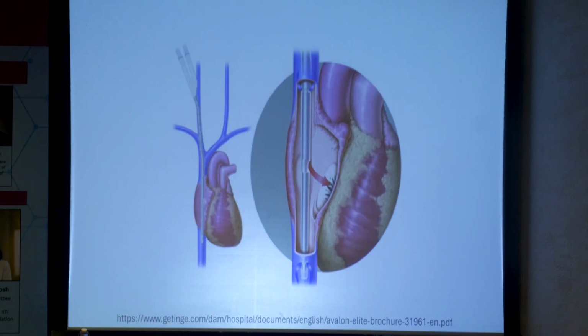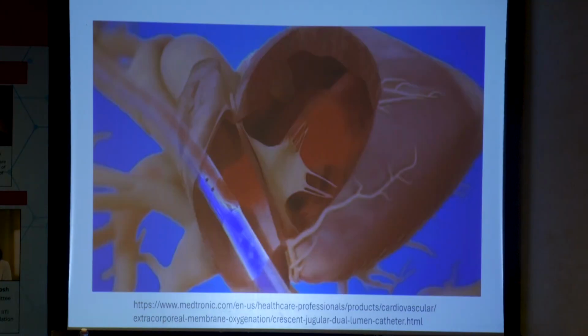And here's another. I went online and found multiple pictures just to really hammer home what we're looking at here. You want that blood flow to be going towards the tricuspid valve into the right ventricle. Here's one where they show it in red, going across the valve into the right ventricle, and you see the blue blood draining from below and above the outlet lumen there. There's at least 2 manufacturers in North America of these cannulas. I don't know if there are more that you're aware of, Steve.